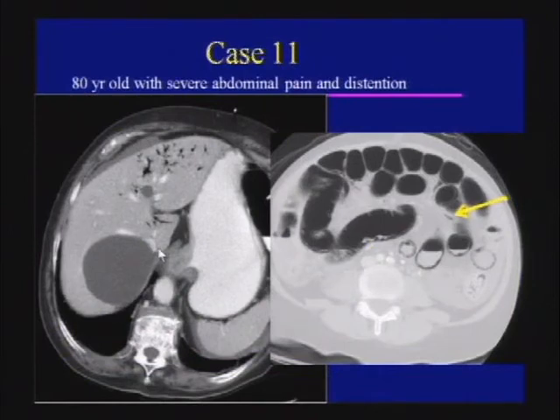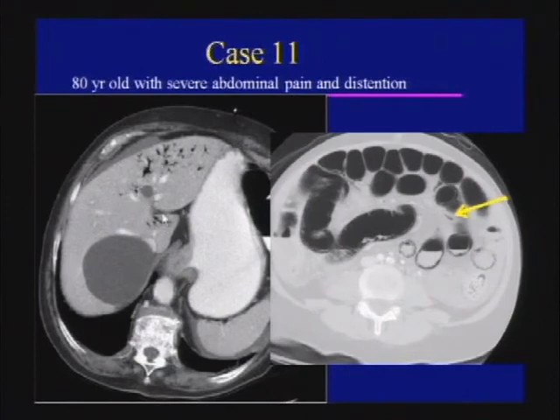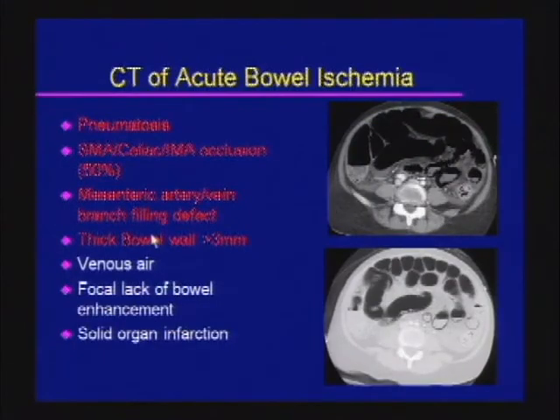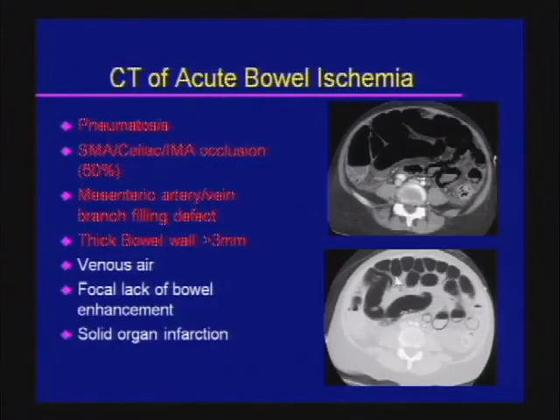The last case: an 80-year-old with severe abdominal pain and distension. The liver shows an odd collection of gas in the crow's feet distribution — in the periphery of the liver, not centrally as expected for pneumobilia. Because of the direction of bile flow, biliary air is central; portal venous gas is peripheral, particularly in the non-dependent portions. Lower images show dilated loops of bowel, mesenteric air, and pneumatosis within the bowel wall — acute bowel ischemia.